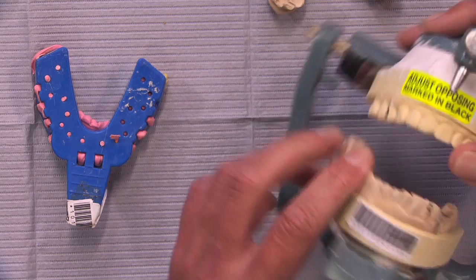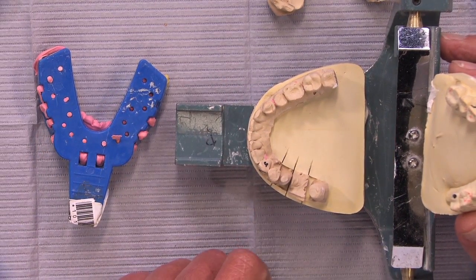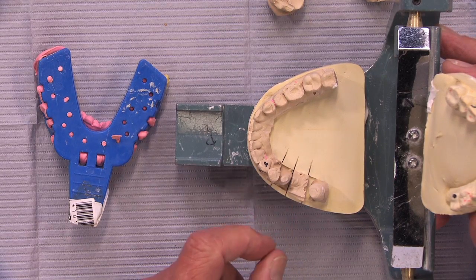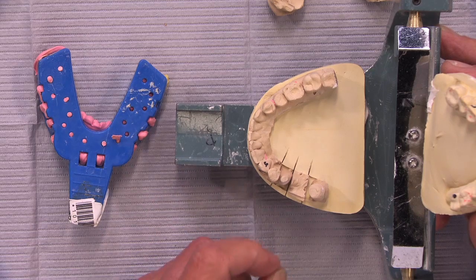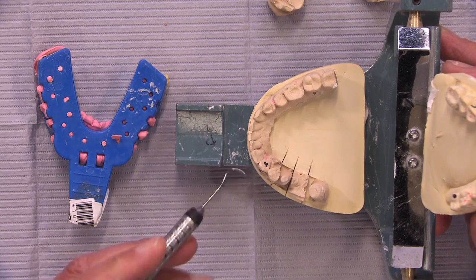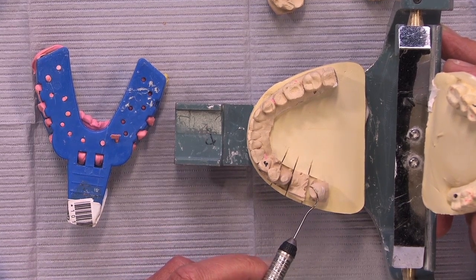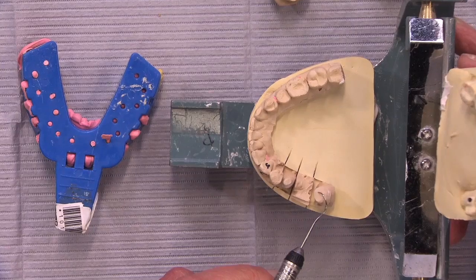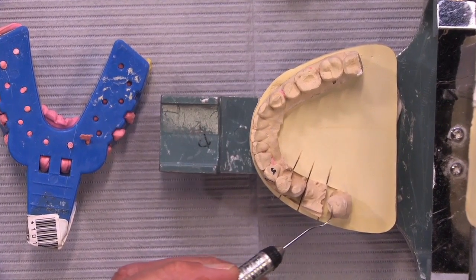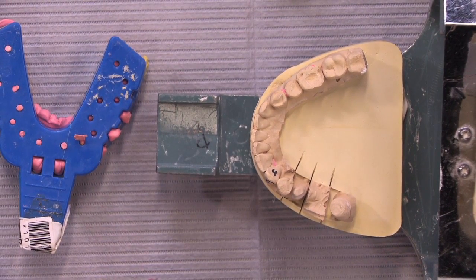Now sometimes if it's on the preparation, it'll be a reduction coping. You've seen different reduction copings that we do. Some of them are thermoformed. My favorite ones are metal. Those are a little more expensive to fabricate. I can deal with the stiffer thermoformed ones. But in a case like that, we'll have a reduction coping that fits over this molar, and typically there'll be a cutout, say on one cusp tip, where the cusp tip will be sticking out of the reduction coping, and we just want to take the bur back and forth and reduce that cusp tip down to the level of the reduction coping.